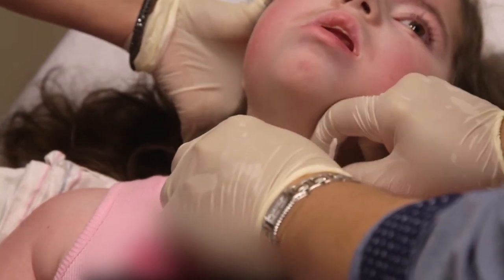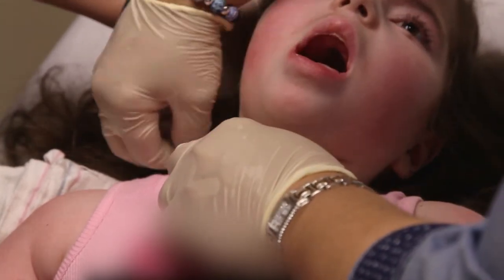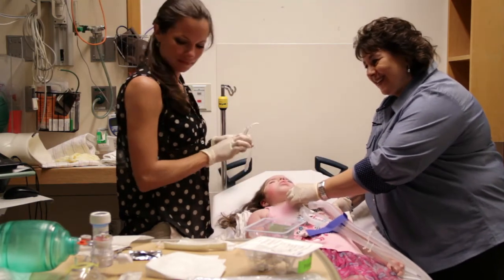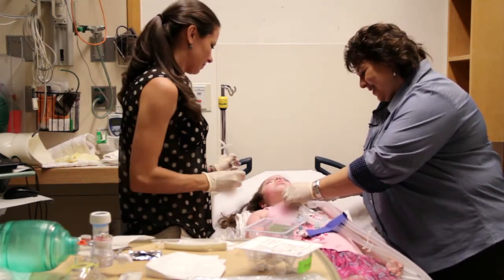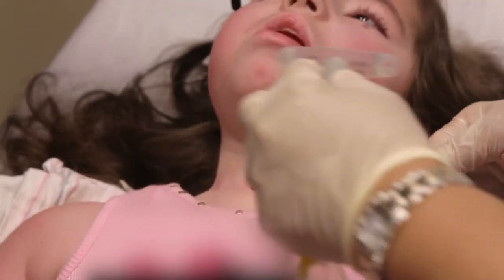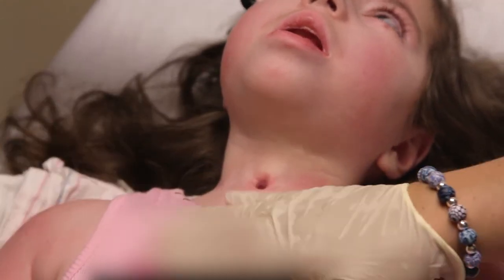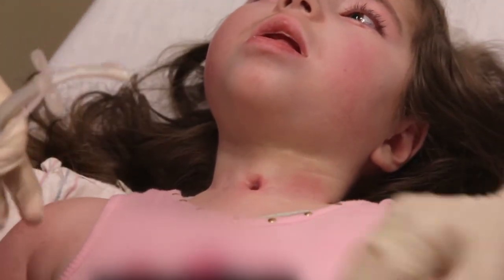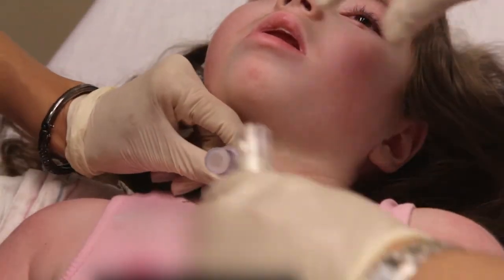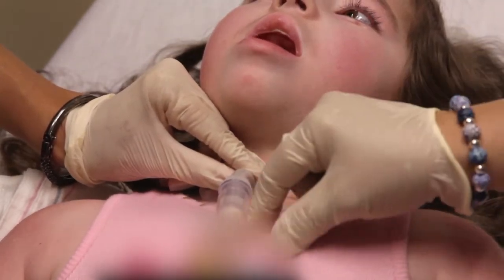Okay, honey. Get that one off there. Are you ready? Okay. When you tell me. I'm good. Okay, there we go, sweetheart. The stoma looks excellent. Round, no white, no granuloma tissue, nothing. The tube is inserted, the obturator is removed immediately, and Drew is placed back on the ventilator.